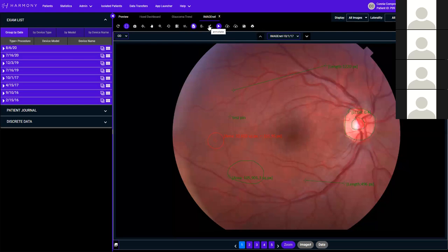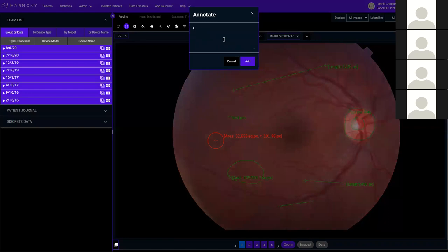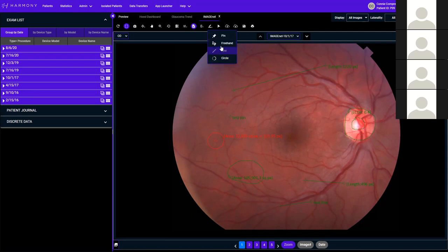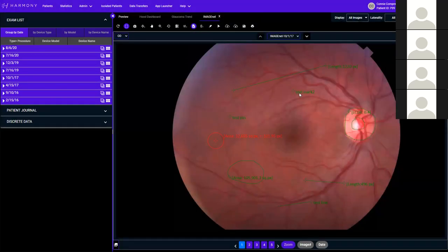There's a select tool to click on each annotation and change its color — your color choices are red and green, which may be subject to change. The next annotation icon is a generic 'annotate' tool with freehand, line, and circle tools. When you complete the drawing, instead of a number, you get prompted with a text box where you type what's applied, and it puts your text on screen next to that markup. There's also a pinpoint tool that puts crosshairs — just do a quick click with the mouse and it automatically prompts you with a text box to type something right where you clicked.